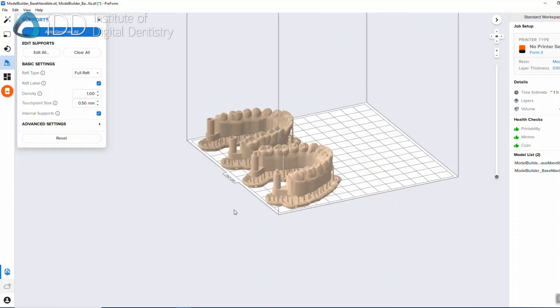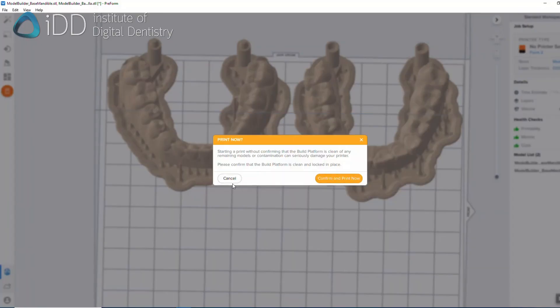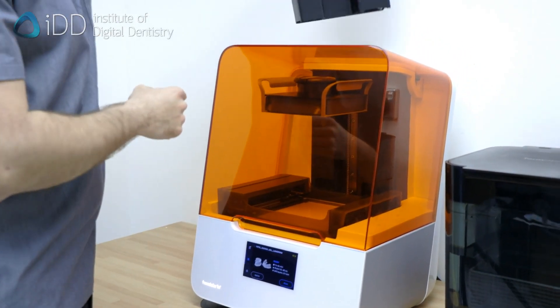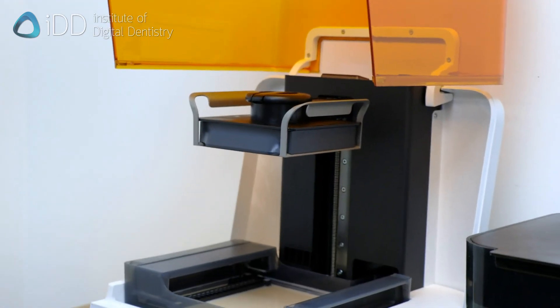Once we are happy with the design, we set it up for 3D printing using the 3D printer's slicing software. We can now prepare the 3D printer. Here we are using the Formlabs 3B Plus printer, which uses printing cartridges. Insert the cartridge, and make sure the build platform and resin tray are in place.